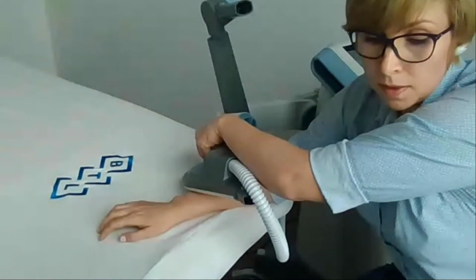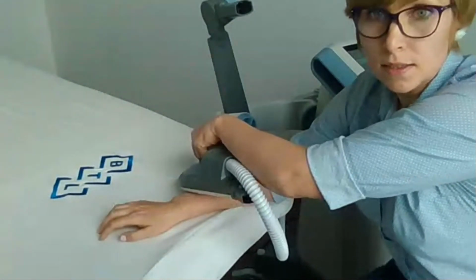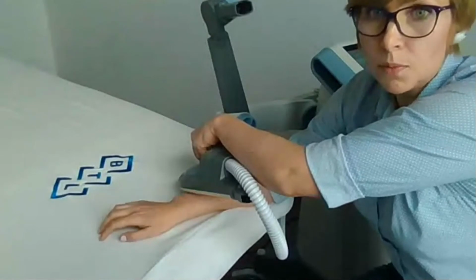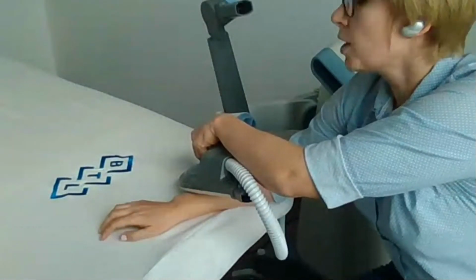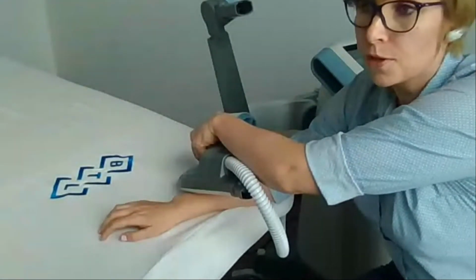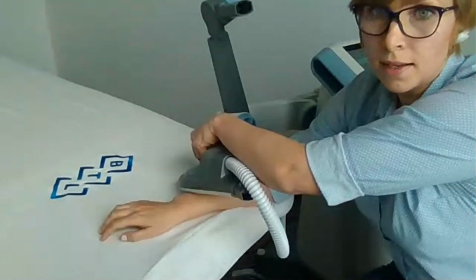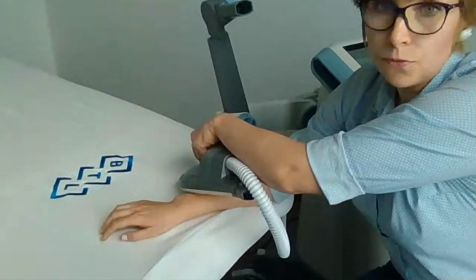So in this case, we have to adjust the intensity level in every session, because every day is different, every patient is different, and every stadium, every disease is different. So every patient has to be treated individually and has to have the intensity adjusted in a different way.